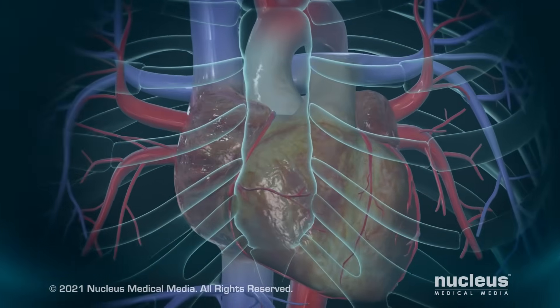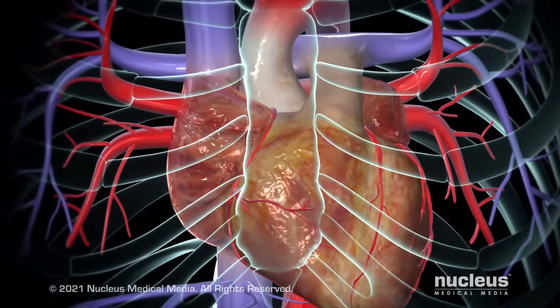If you or someone you know has recently had a coronary artery bypass graft, or CABG, this video will help you understand the steps of the procedure and how it restores blood flow to your heart.